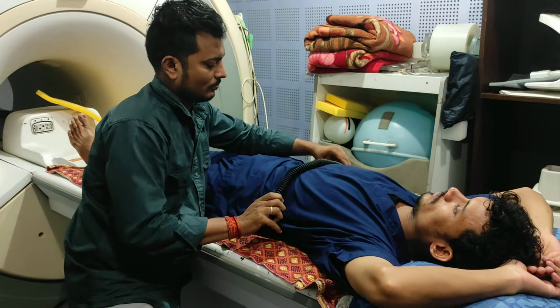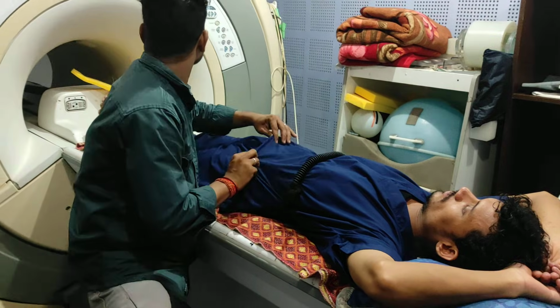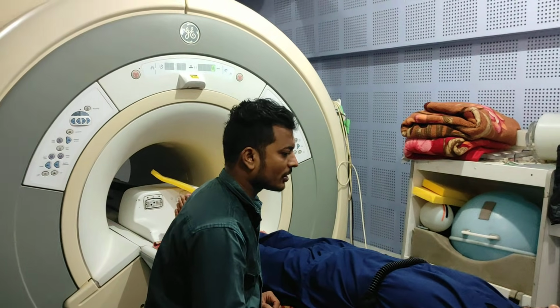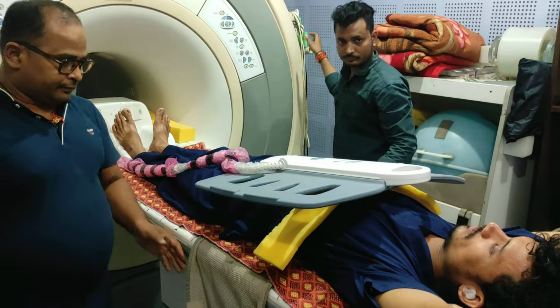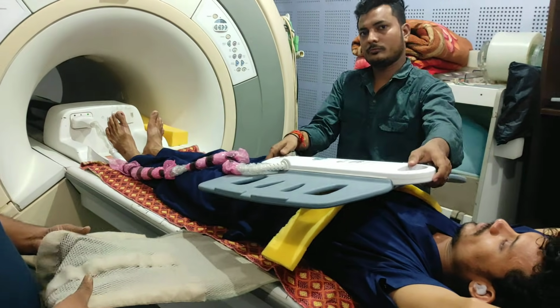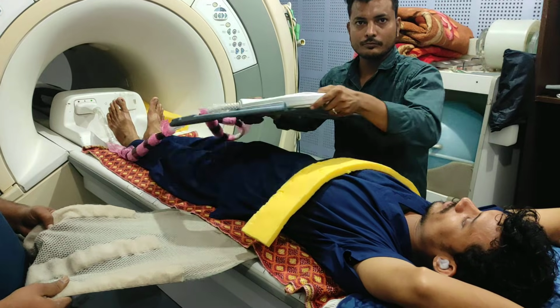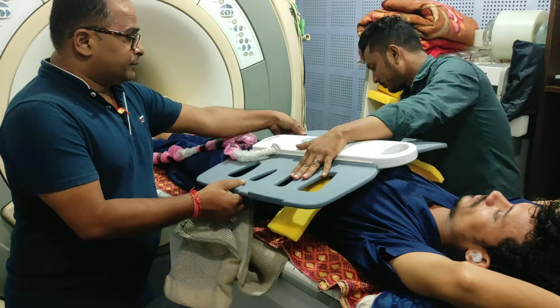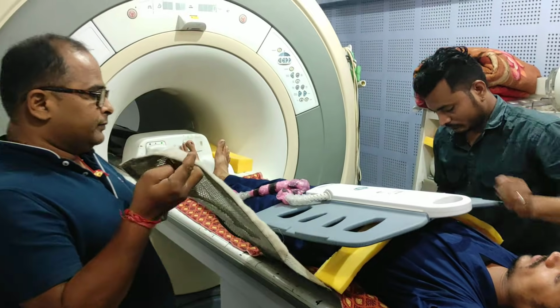Now after fixing the respiratory trigger, you have to place a body array coil anteriorly. This is how you have to place the body array coil over the anterior portion of the stomach. Now we will fix it.